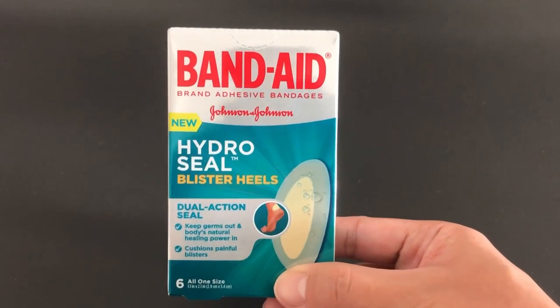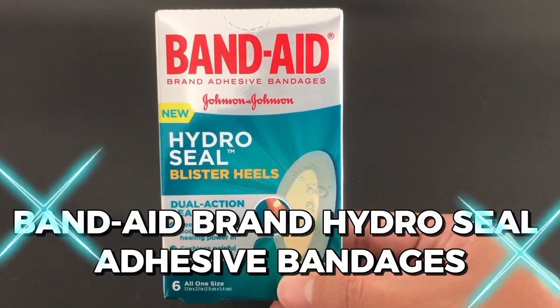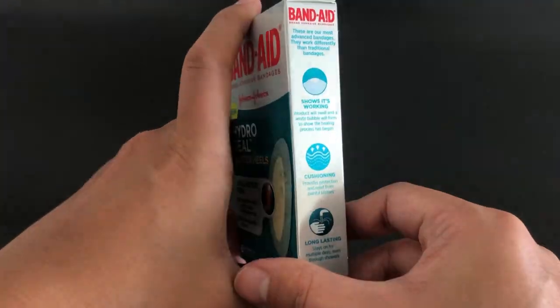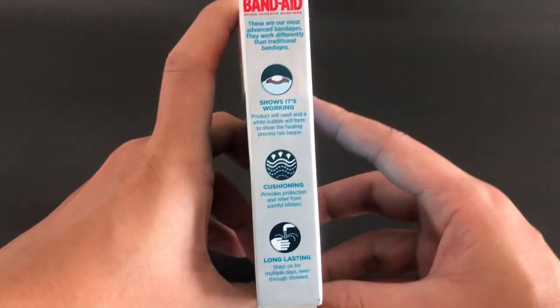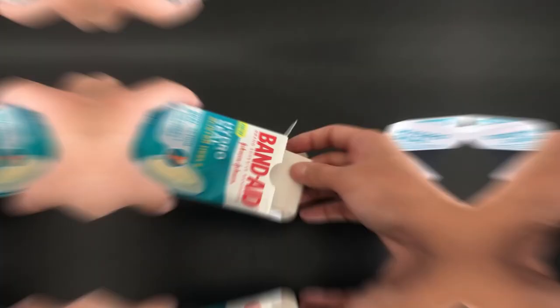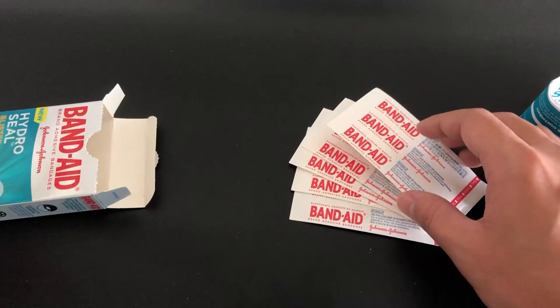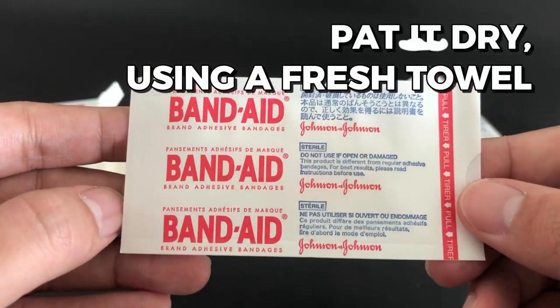Hey everyone, today I'm going to show you how to use the Band-Aid brand HydroSeal Adhesive Bandages so you can deal with your excruciatingly painful heel blisters throughout the day. So let's get started. Washing the area around the blister with warm water and soap is the first thing to do. Pat it dry using a fresh towel.